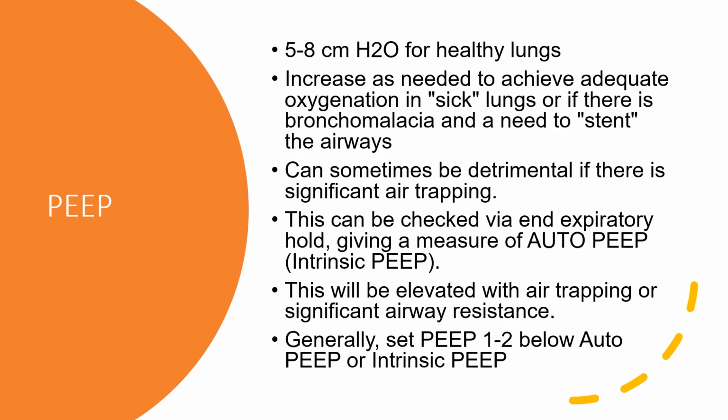So let's talk about PEEP. Quite honestly, I could spend the next 10 slides talking about setting PEEP, and I do have a separate presentation that talks about the exact details of setting PEEP. But for this one, because this is an introduction to mechanical ventilation, I'm going to go over it quick and dirty, and I know I'm going to cause a little controversy here. Typical settings for a patient on mechanical ventilation are anywhere from 5 to 8 centimeters of water of PEEP.